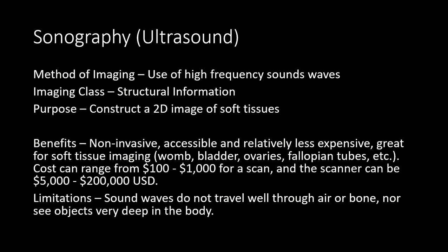The limitations, though, are that sound waves do not travel well through air or bone, nor is it able to see objects that are very deep in the body.